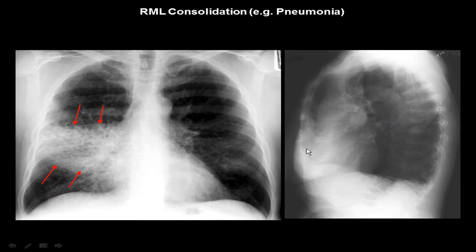We are going to talk about the pathologies now. What can we see about this case? It's a posterior-anterior and lateral plain X-ray showing right middle lobe consolidation. This is a soft tissue density present at the right middle lobe, meaning mostly pneumonia — presence of an infectious condition and pneumonia.